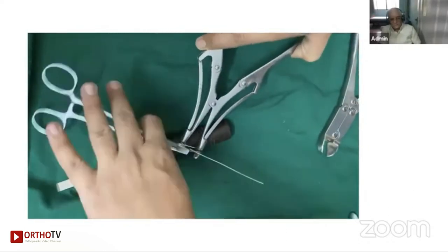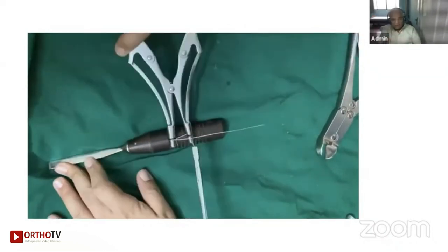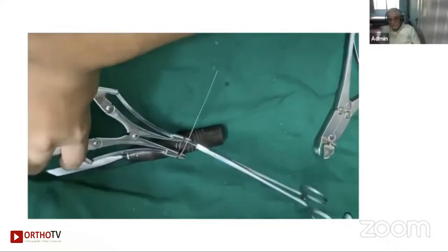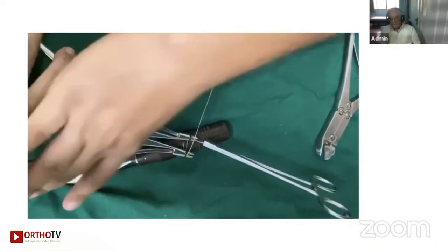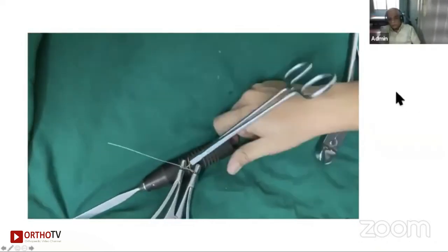And once you twist them, the wire is twisted. And this is the one which I find, again, wherever I work, an Indian instrument at an Indian price. This is, I feel, the easiest instrument which all of you should have.